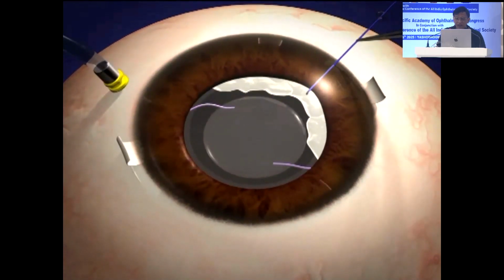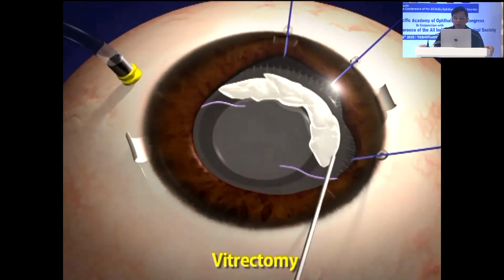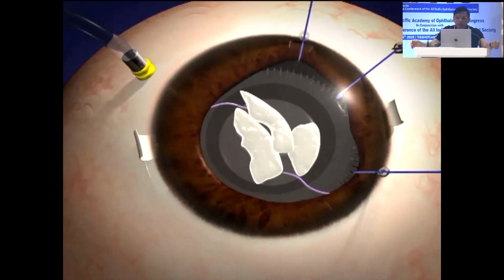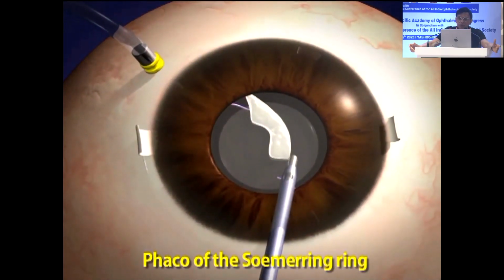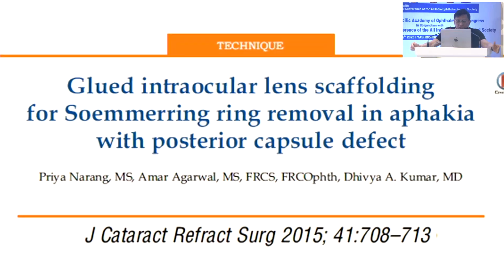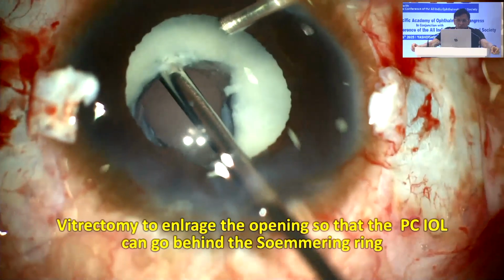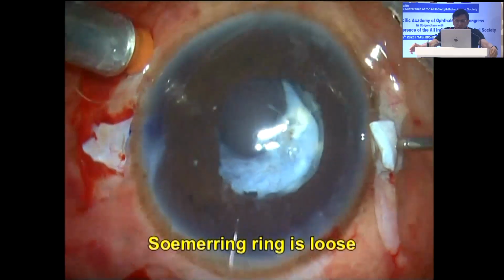Now what I do is enlarge it with iris hooks, break the adhesions between the Soemmering ring and the periphery, bring them to the center, now emulsify this, and that is game, set and match. So in this particular case, that's the way I would like to do it. And we published this in the year 2015. I'm enlarging the iris pupillary defect some more.